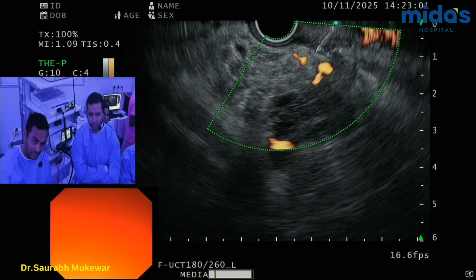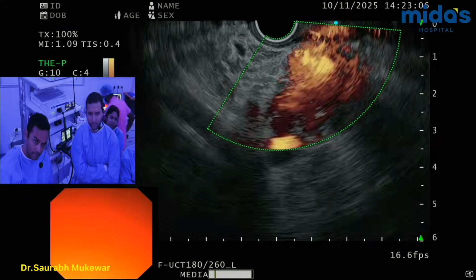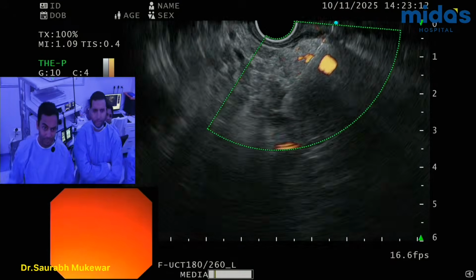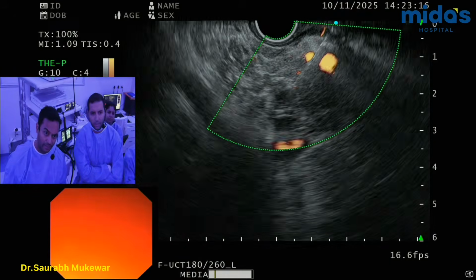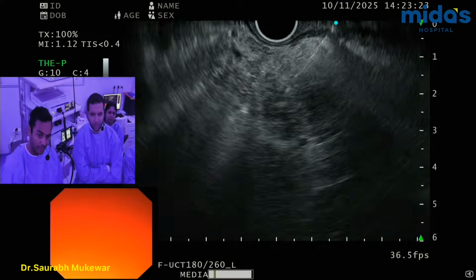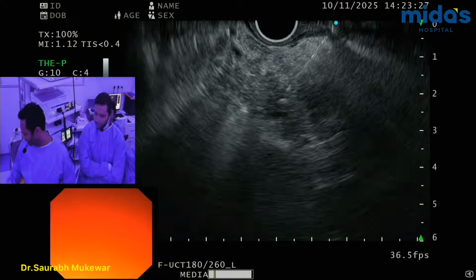Okay, let's see if I can. All right. Am I through? I'm close to it. Near it. Yeah, I think so. The idea is to be between those vessels. So I believe I have been very close to the pulsatile one. In between the two. Yeah, I think. And inside the. Okay. Yeah. Please. Okay. Don't experiment. Come on. Not now. Next case.